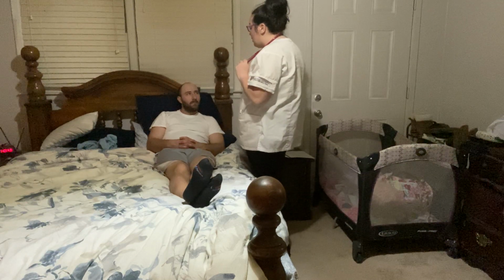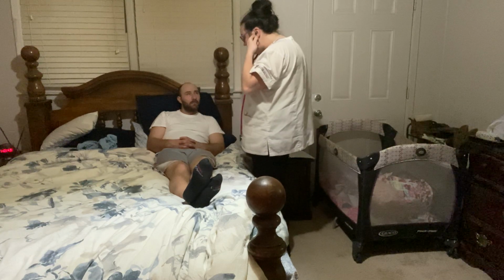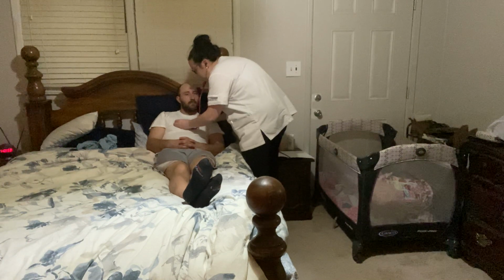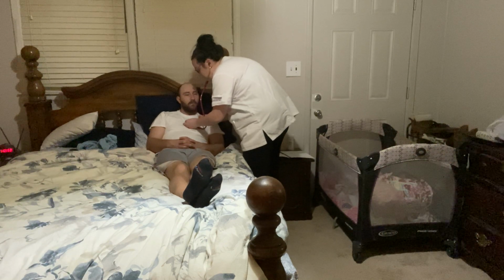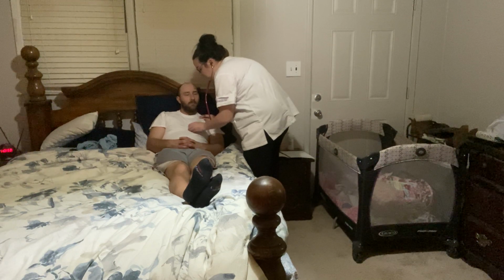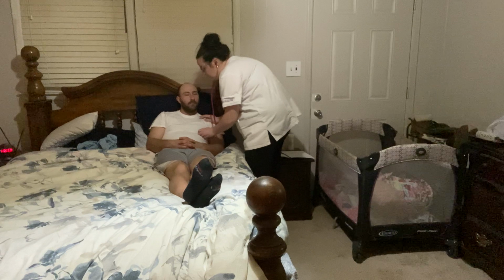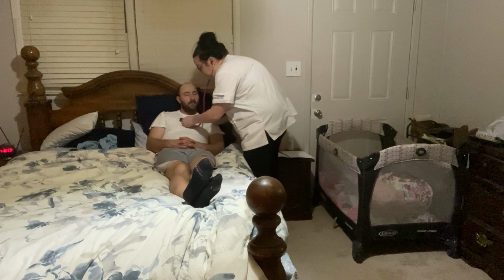Next I'm going to listen to your heart. So place my stethoscope. Okay, so I'm going to start on this side and listen to your aortic valve. And then move to your pulmonic valve. And then your Erb's point. Your tricuspid valve. And your mitral valve. All of those sound good, so I'm going to swap and do the same thing. This time I'm listening for any kind of murmurs.